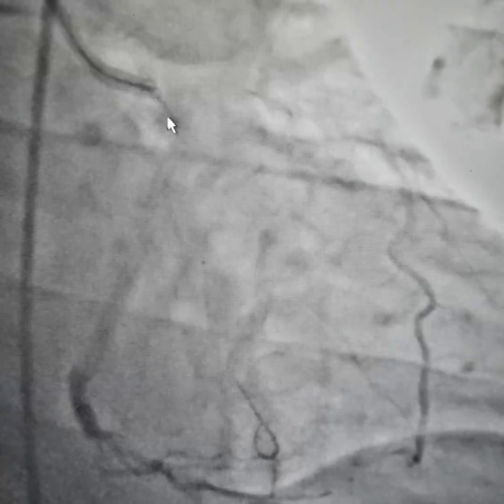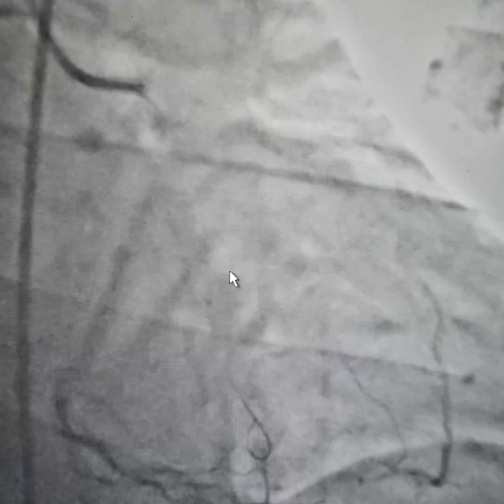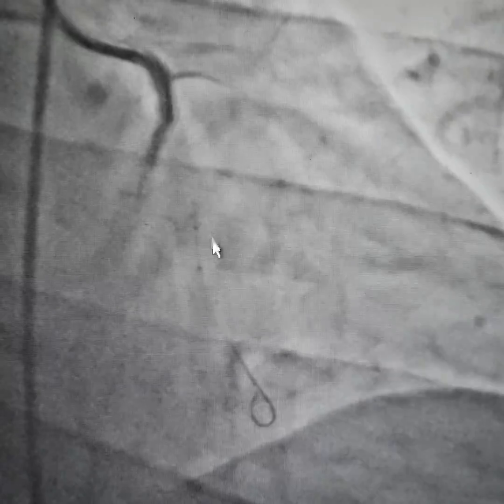We wired it using a Whisper ES wire, then we did a small dottering with the balloon. After the dottering, we pre-dilated the lesion.